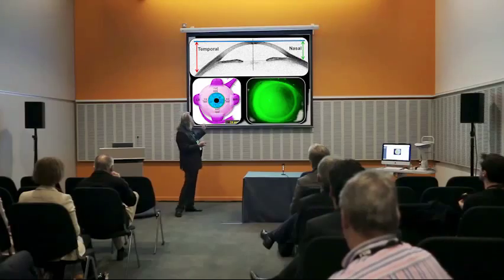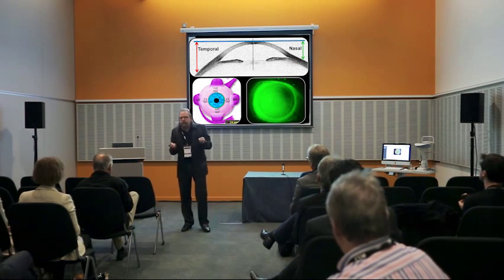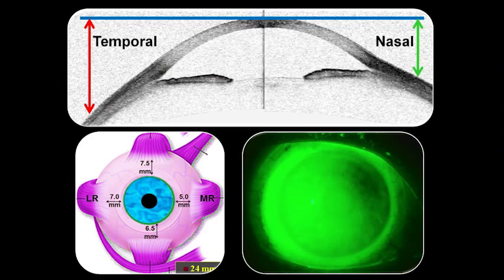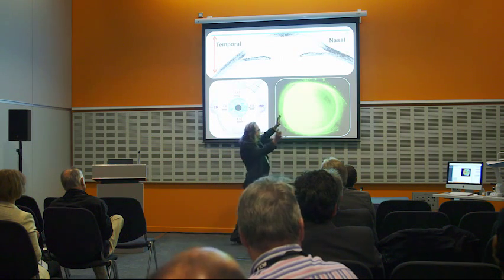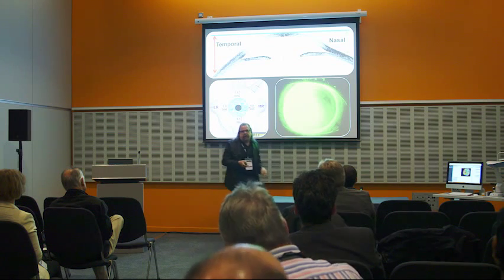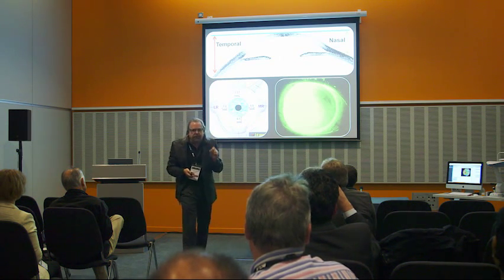Now, what does that all mean to us clinically? It means when you have this kind of human asymmetry to the sclera, when you apply any scleral lens, regardless of the manufacturer, it is going to hit first at the area of greatest elevation.